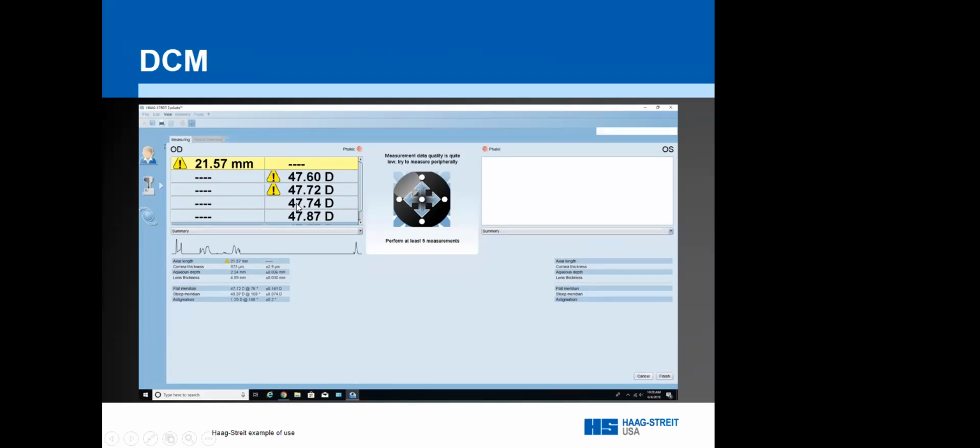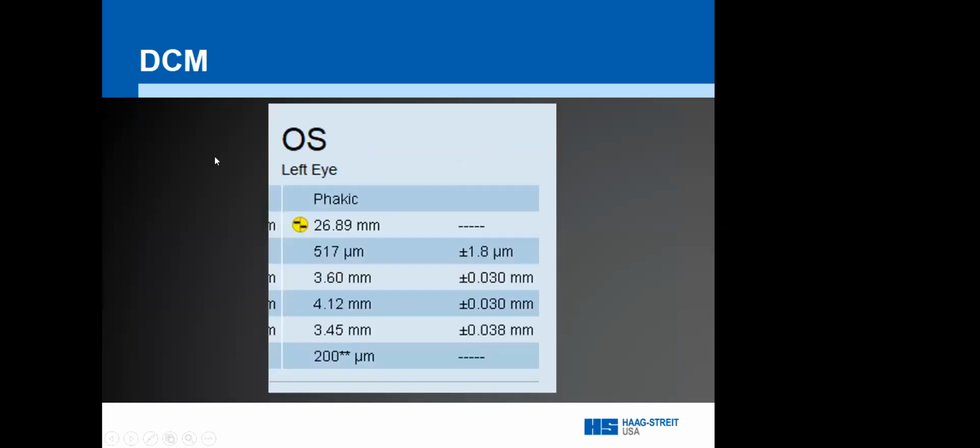And over the first 3 scans, the same thing happens. And then after the 3rd scan, a composite axial length populates at the top. Additional scans done afterwards will continue to build on this composite, and you will never have a standard deviation with a composite axial length alone.